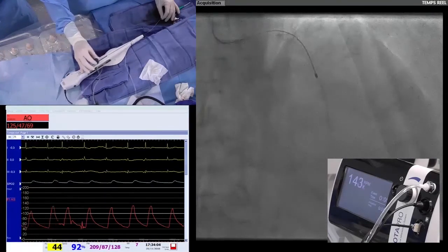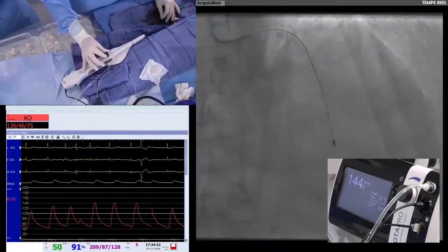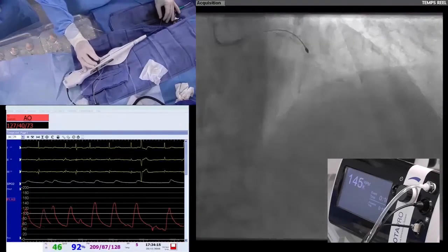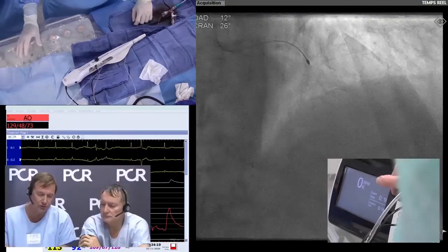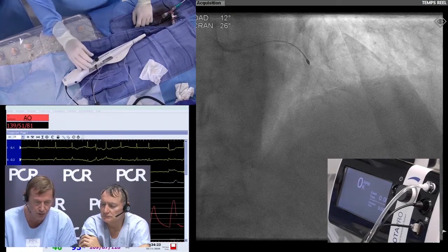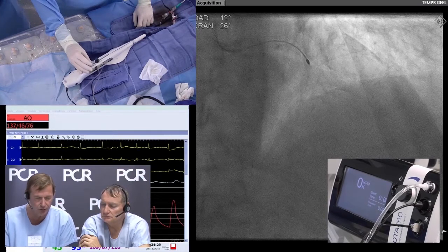Do you recommend RotaGlide for the ROTAPRO system? Well, that's no longer available to us. It did make it very useful, I have to say, when we had it available. When changing burrs, do you need a new drive unit? No. The exchange mechanism for changing the burrs is exactly the same as the old system. So you keep the same drive unit throughout your case, even if you want to change two or three burrs.